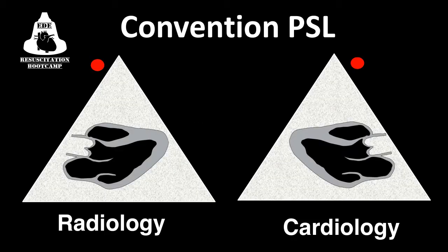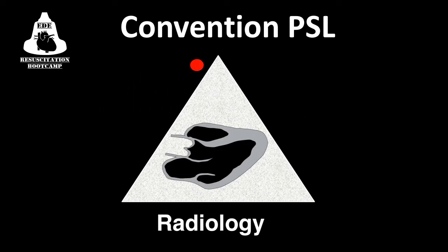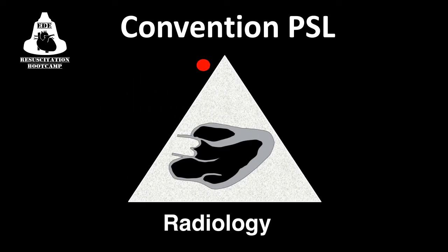Before we proceed, it should be noted that the radiology convention for the parasternal long has the indicator on screen left. Cardiologists place the indicator on screen right, which means the heart will have a reversed orientation. We will be using the radiology convention since this matches the orientation of our probes for almost all other applications.